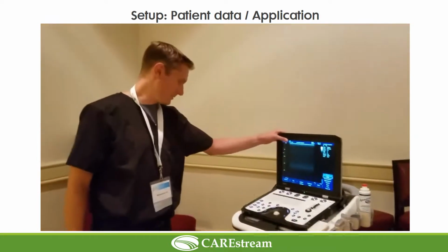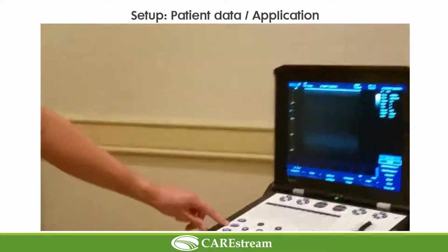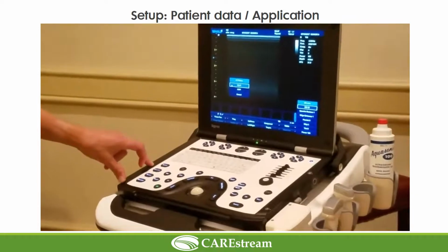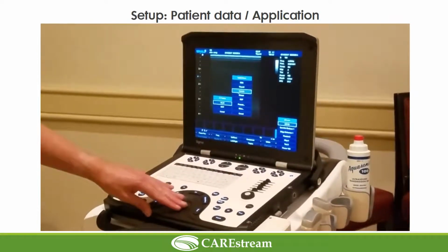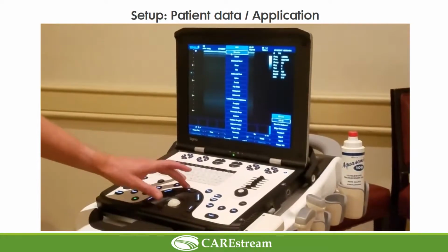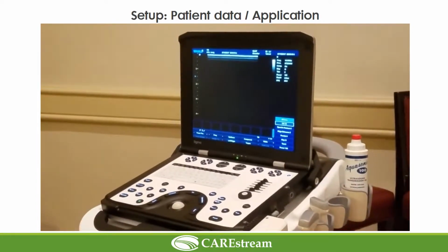Okay. We're first going to look at a shoulder. So we go down to the next button under patient, and it says application. Press here. Which probe for the shoulder would you like to use? The 12 linear probe. We're going to press set again. It'll bring up different options. Under the MSK option, we're going to find shoulder. Now the machine goes to its preset for the shoulder examination.